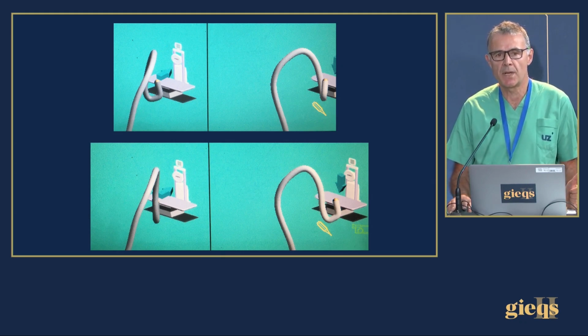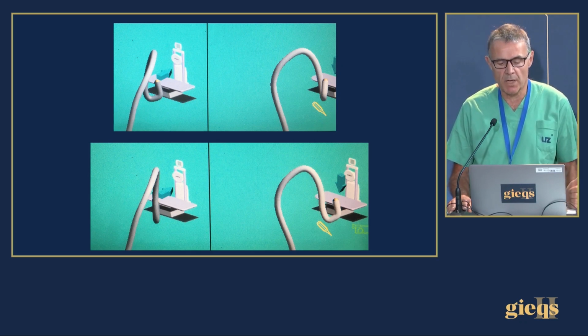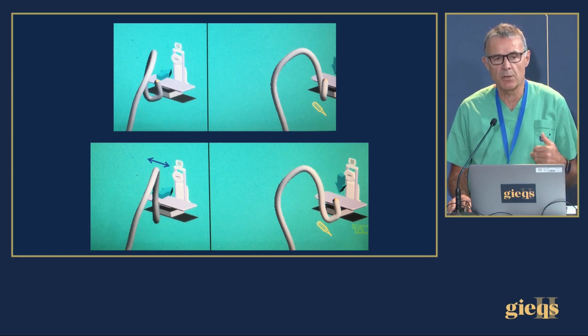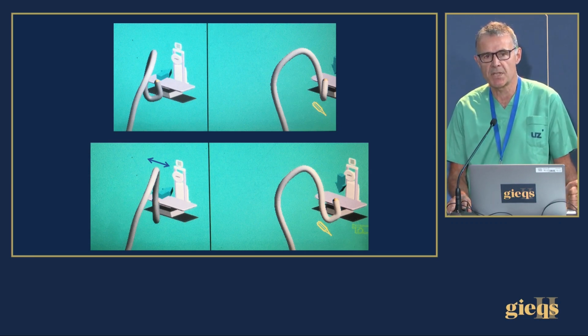And when it's in one plane, you can gently withdraw it, and I know that there's a risk of the scope flopping one way or the other, and that this must be watched for. You can feel it happening, but if you keep it all in one plane and pull back very slowly, then you will not lose the position.